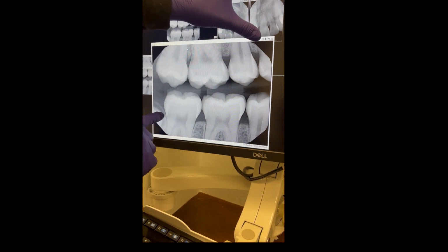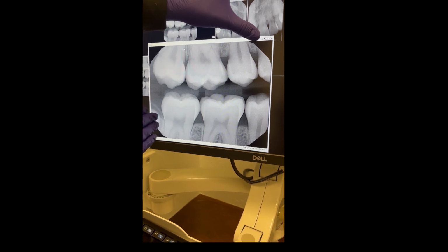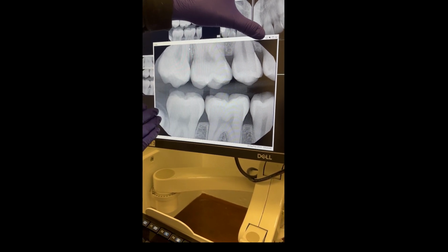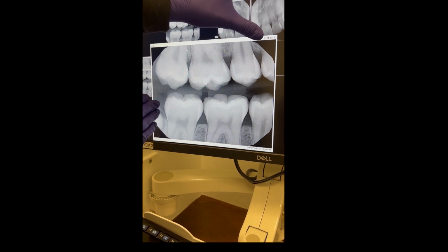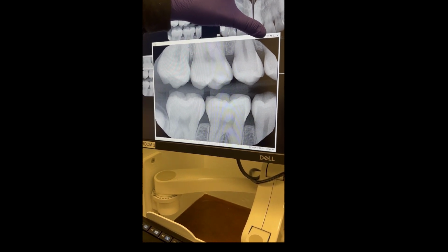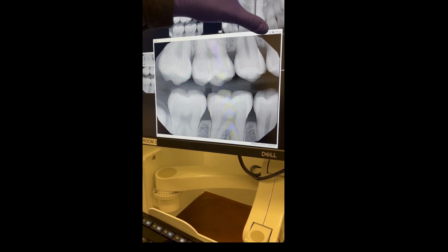I'm also 2 millimeters behind the last molar in the patient's mouth. This is a wisdom tooth. We're not going to count that it's impacted, but 2 millimeters behind the last molar in their mouth is what we're trying to capture in the molar image.